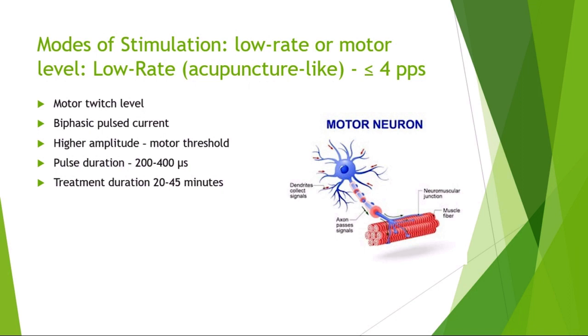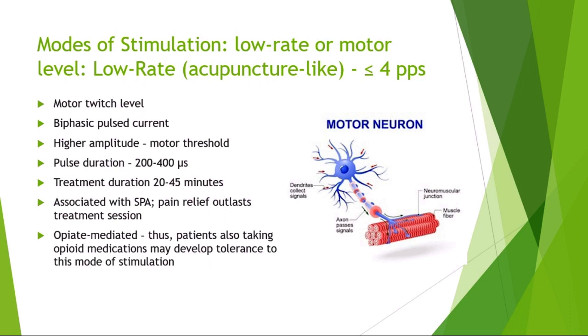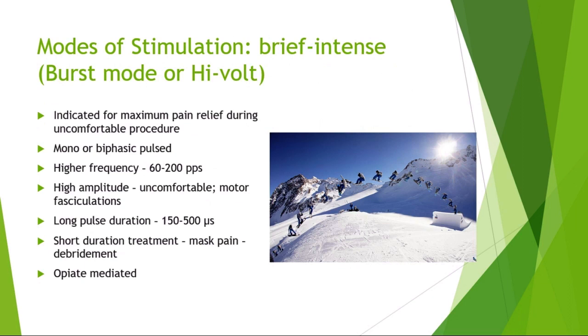A little bit longer treatment duration potentially, 20 to 45 minutes. Associated with that stimulation-produced analgesia, where we're stimulating the midbrain to produce those endogenous opiates. So the pain relief outlasts the treatment session. Normally with conventional high rate, the pain relief only happens during the treatment session. With this, the pain relief outlasts the treatment session. It's opiate mediated, thus patients also taking opioid medications may develop tolerance to this mode of stimulation. They might already have a tolerance to it because they've already used up their opiate receptors with those medications.